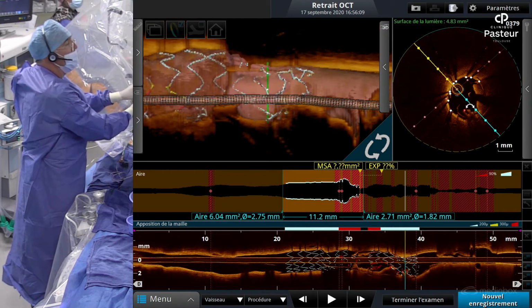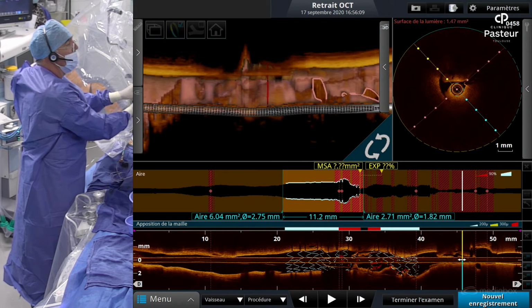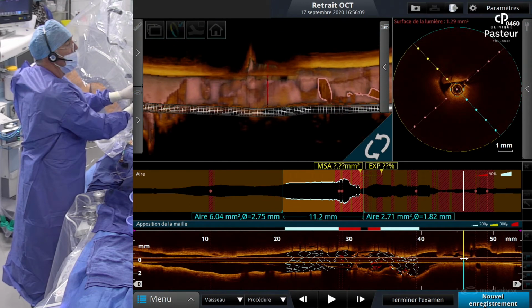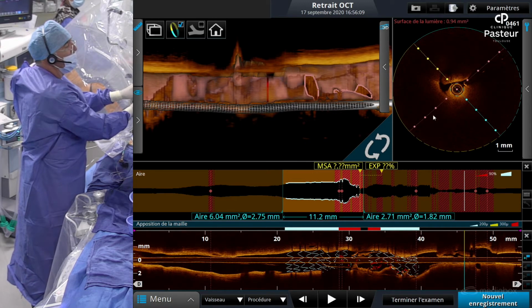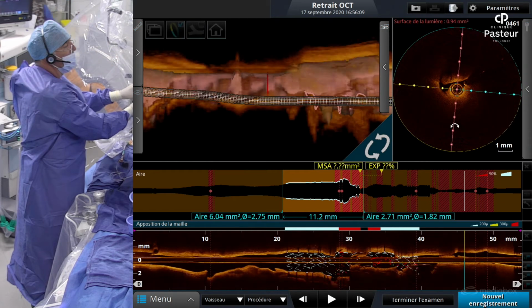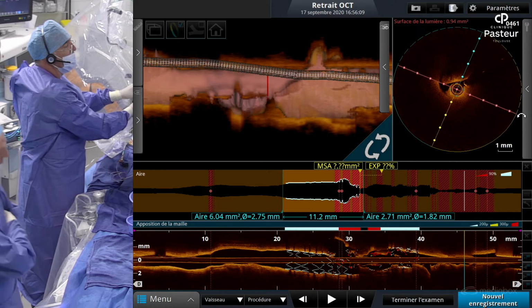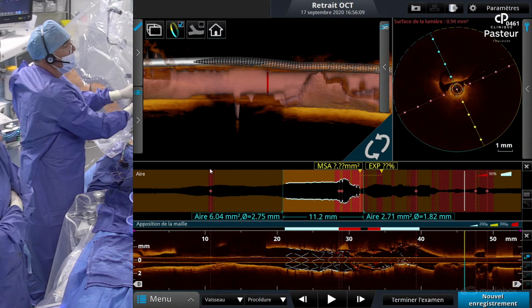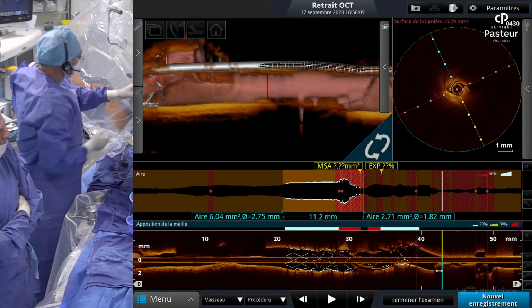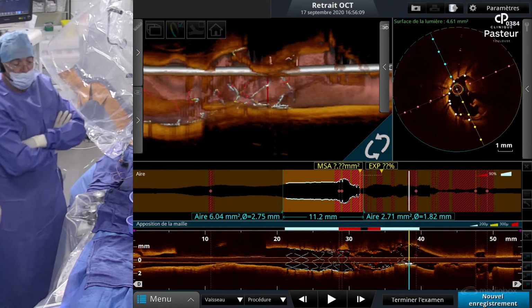It was 2 stents on the LAD and the left main with 1 stent, and then provisional T bifurcation. That's a possibility. The only concern is that at the level of the left main, if you use a 3.0 millimeter diameter stent, you will never achieve 5.0 millimeter diameter. So if you want to do the left main and the LAD diagonal bifurcation with only 1 stent, then you need a 3.5 at least.